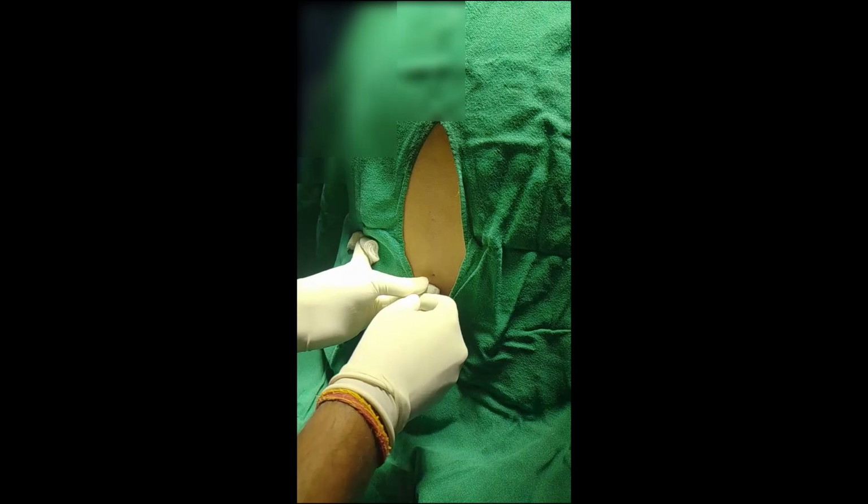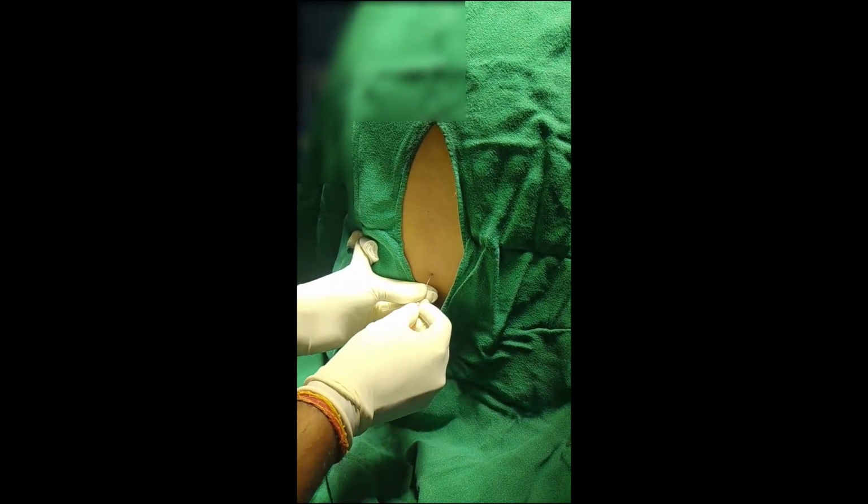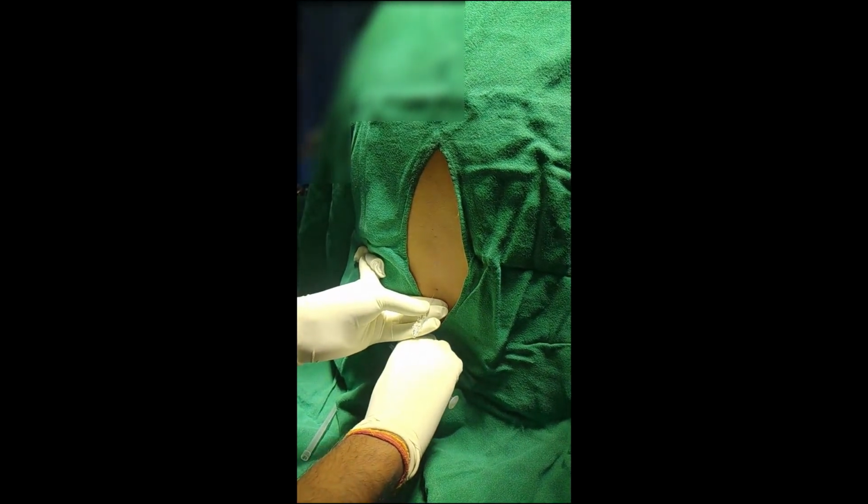I am introducing the needle slowly. I think I should go a little more inside. Here we go. Got the CSF. Can you see the CSF now?